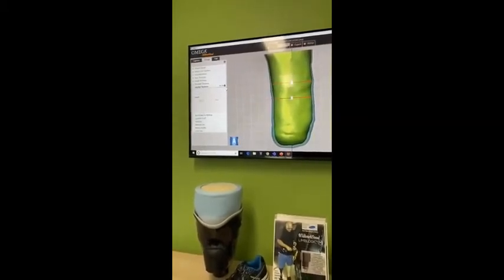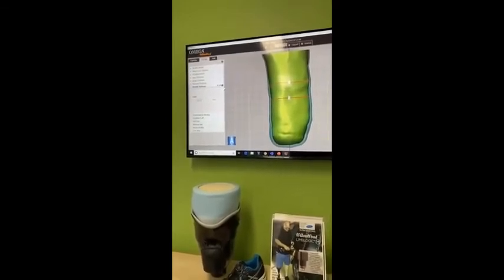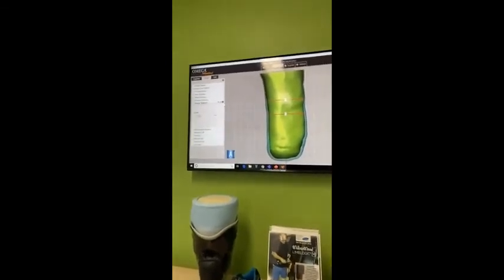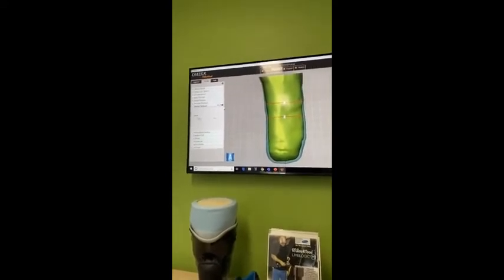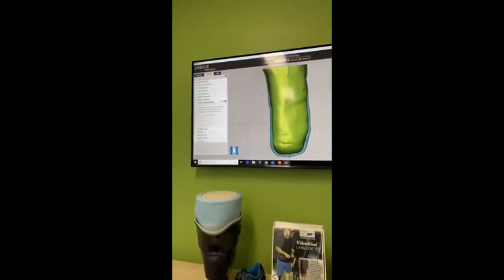Medial thickness obviously can be skipped, or yeah, you can change the medial thickness of the wall. Again, we can reduce or increase that.